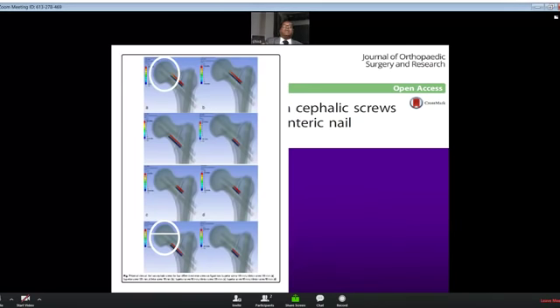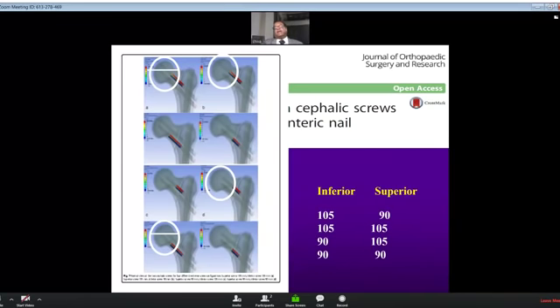The second model they used was a longer superior screw. When the longer superior screw was used, the load was taken by the superior screw. Then shorter inferior screw and longer superior screw, and a normal superior screw and a shorter inferior screw. These are the different varieties they tested, and for your understanding, I am just saying the first one has a longer inferior screw, a 105 millimeter screw, and a shorter one at the same horizontal level as the next screw is the 90 millimeter screw, which is depicted in this picture.